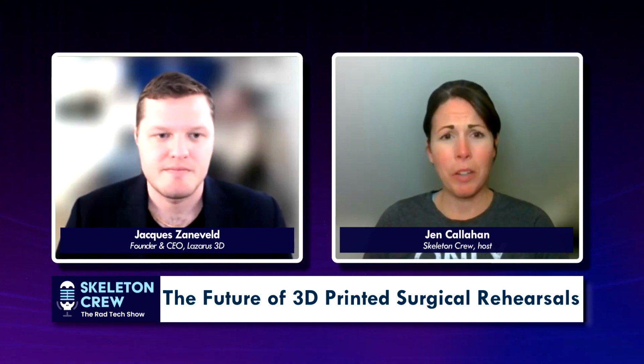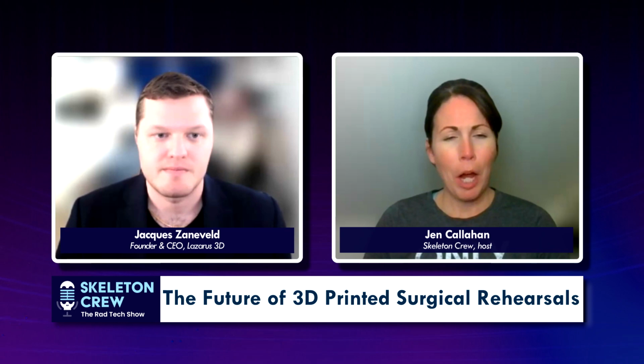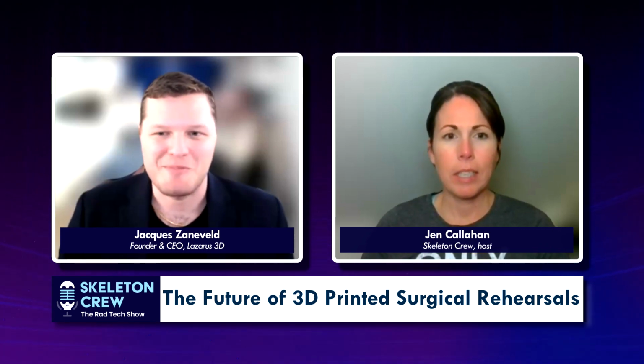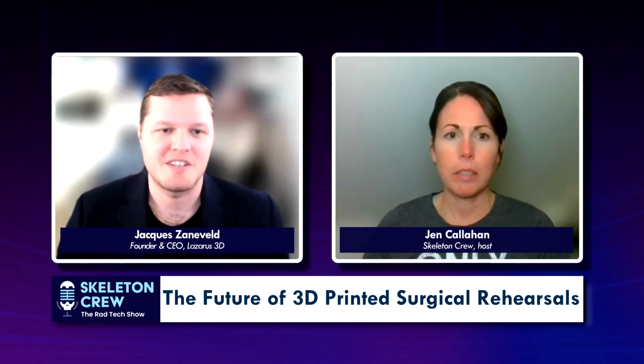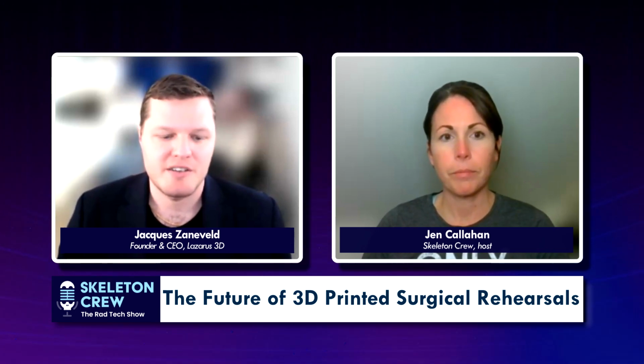Wow. For the congenital, I can't even imagine how intricate that is. And are you using CAT scans and MRIs usually in tandem to come up with these models? Yes, it depends on the type of surgery, of course, but we'll typically receive the entire radiological workup for the patient, and we'll typically use the best scan for the structures that we need to resolve.